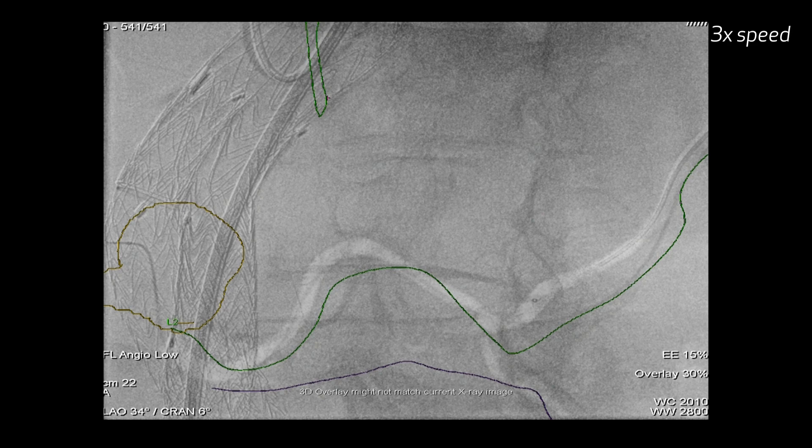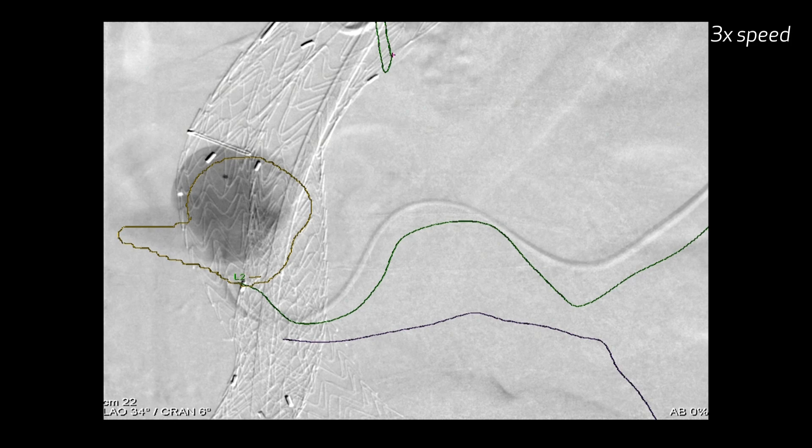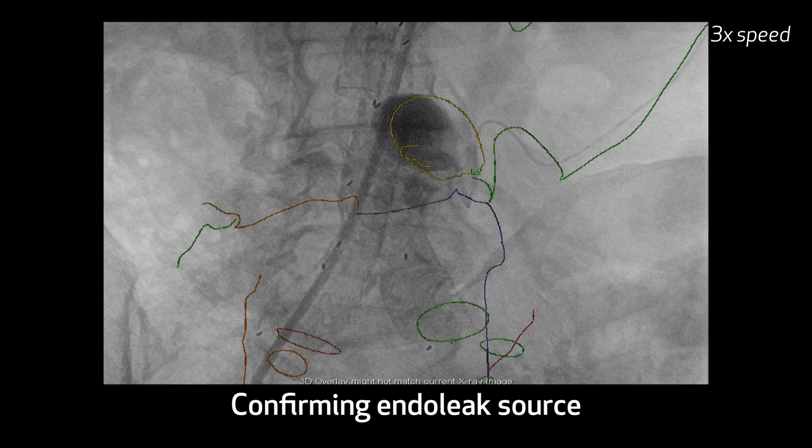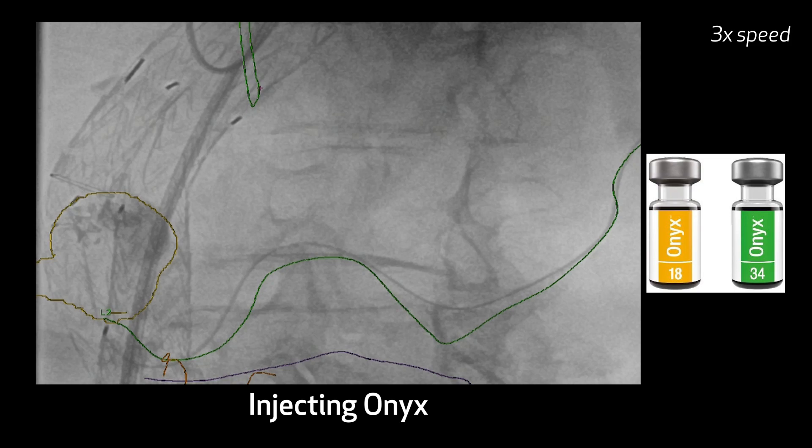It looks like we're in the aneurysm — we've advanced there. You can see the microcatheter with the arrow marker. You're going to inject dye and confirm that you're actually in the aneurysm sac, although we're 99% sure. What is nice is how we see how it conforms to the markers that we drew on the CT scan. The critical part here is that first sigmoid branch — we don't want to take that out.